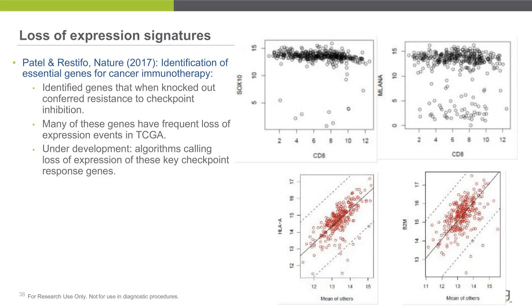Yes, that's a really good question. So when I look at data from a small clinical trial and I see that response to a therapy is correlated with the tumor inflammation signature, I say, great, you're enriched for responses in hot tumors. We can improve the power of your trial because we can exclude the immune cold tumors and get rid of a bunch of non-responders while holding on to the responders. The other situation, of course, is that we see immunotherapy in which response is not correlated with the TIS. In which case, I say this is really great. It looks like your drug works just as well in immune cold patients as in immune hot patients.